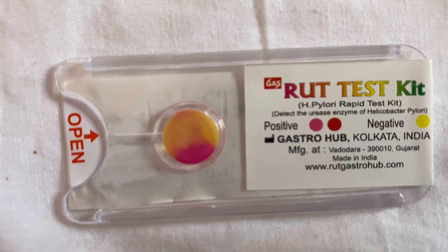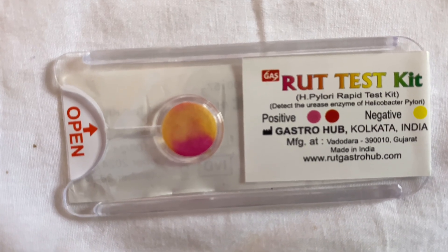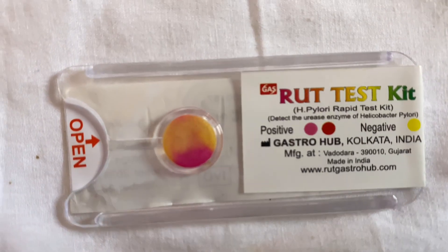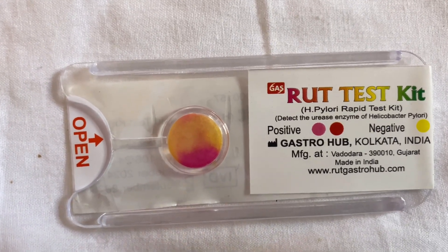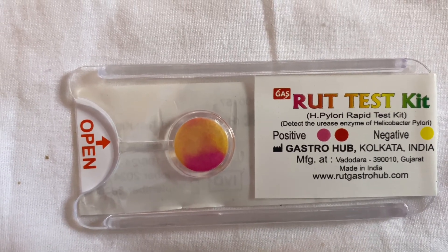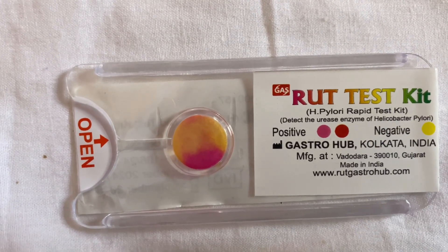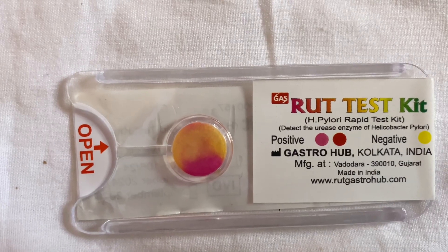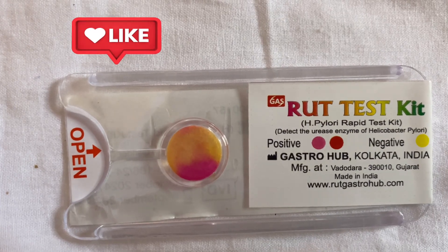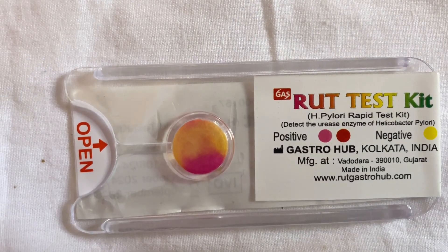The stomach tissue is taken from the antrum or the corpus and placed into the solution or the test gel at room temperature. It is observed for a change in color for up to 1 to 3 hours based on the instructions given on the RUT test kit. Some kits recommend observing for the first 1 hour, and some ask to observe for up to 3 to 24 hours. But commonly, a result is seen within the first 10 minutes or within the first hour.